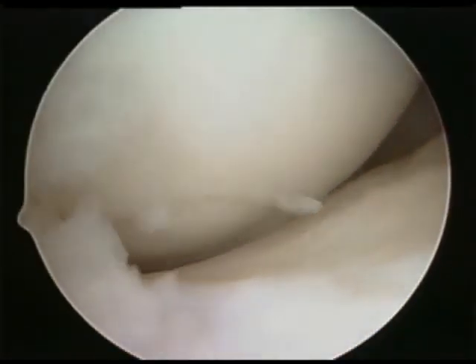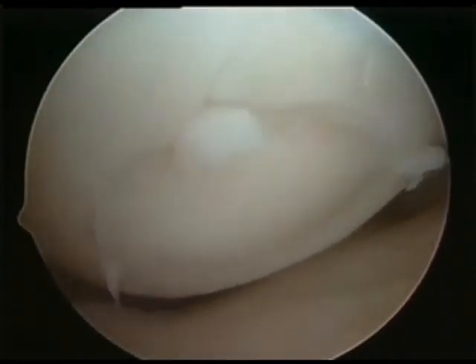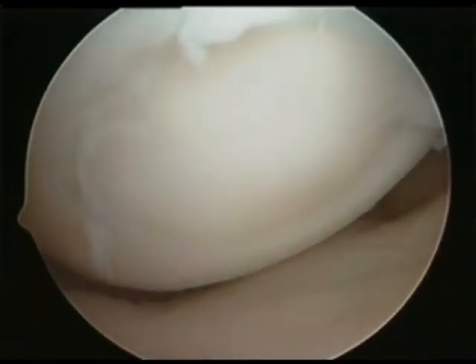After the impaction process, view the knee during cycling to assess for the level of the plug relative to the surrounding articular surface.